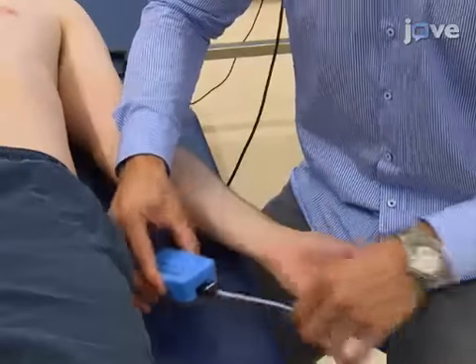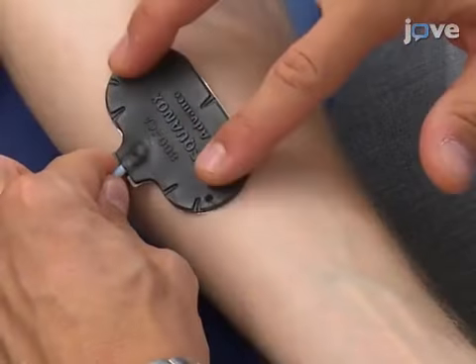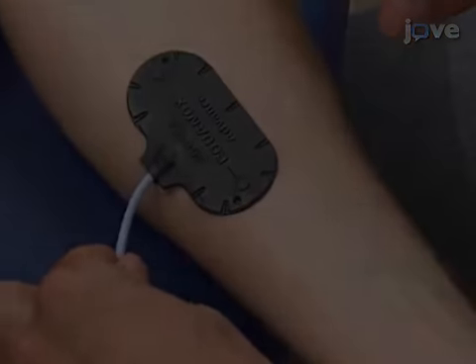Use a second electrode to measure the peripheral tissue oxygenation. Place it on the inside of the lower arm. Avoid placing this electrode above a venous plexus.